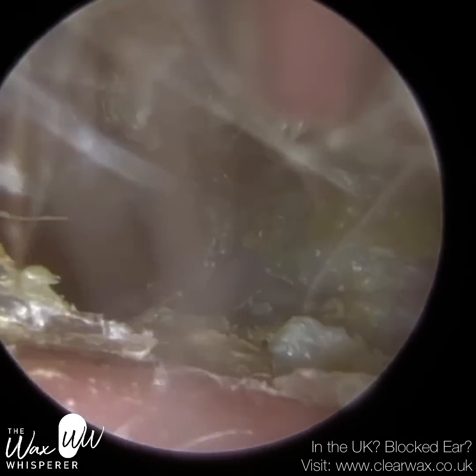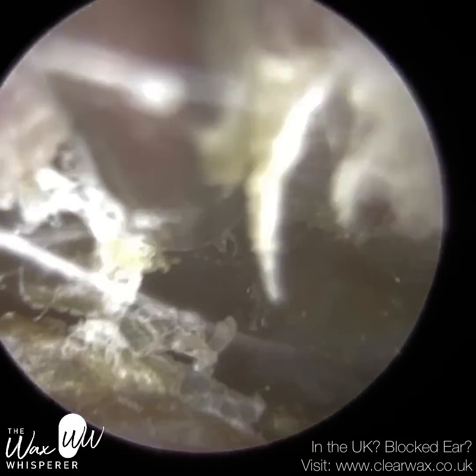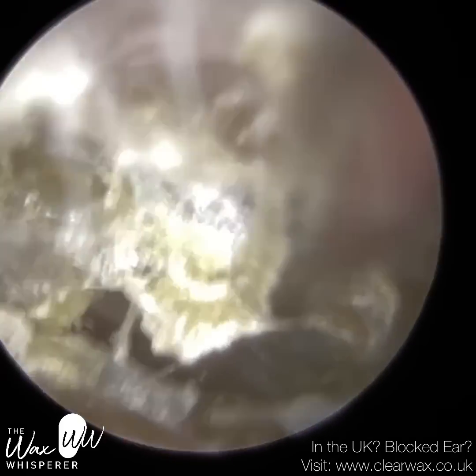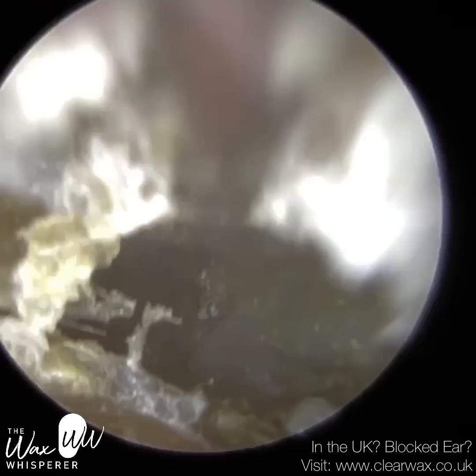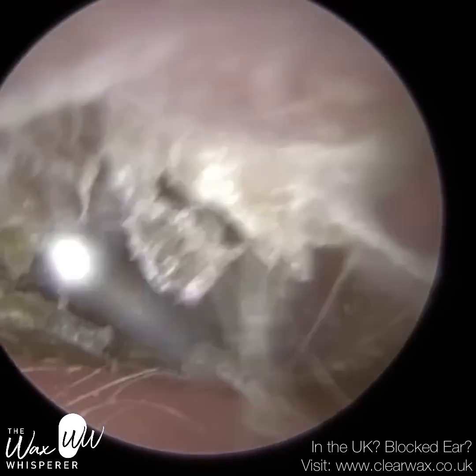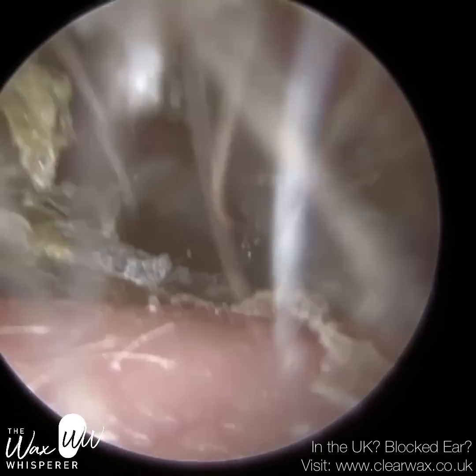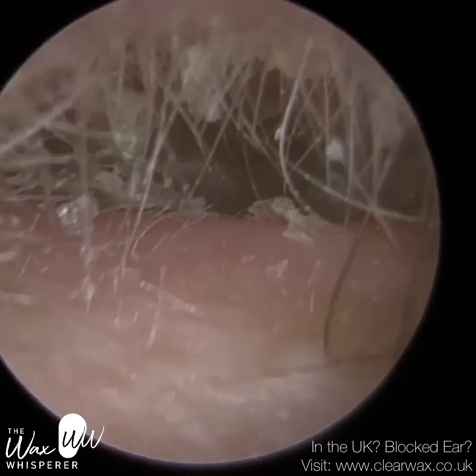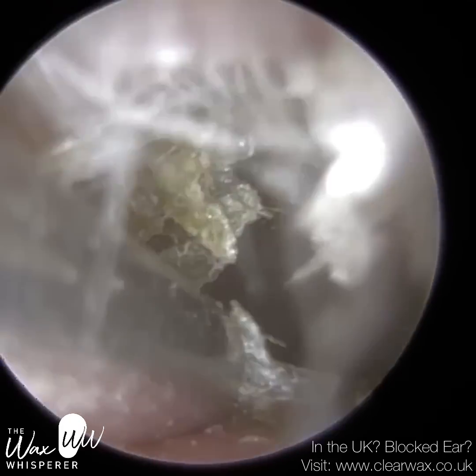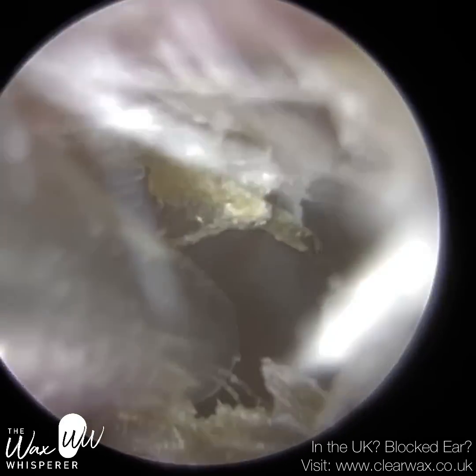I just want to clear the ear canal first. You can see we've got this crusted layer of dead skin both at the roof of the ear canal and also on the anterior portion — the front part. I'm using a fine end suction probe. Although the fine end is less powerful, because the tip is narrower the suction is sometimes more concentrated, so in one way it's less powerful, but the reduced power is more concentrated, giving you a better suction grip.